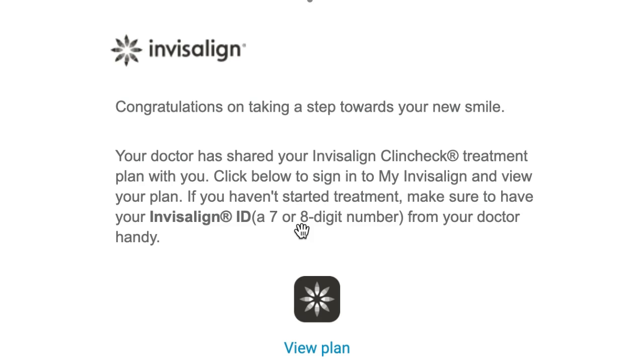But even what if I had a periodontist that wanted to look at it and they're not an Invisalign provider, right? Or a prosthodontist and they're not Invisalign, or an oral surgeon and they're not an Invisalign provider. What if I want to share this with them? Now you cannot, because the only way you can do this is if you register as the consumer. And like I said, you have to provide a lot of information. But anyways, frustrating, very, very frustrating. Align Technology, hopefully you listen to this.